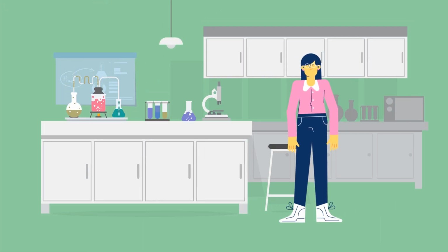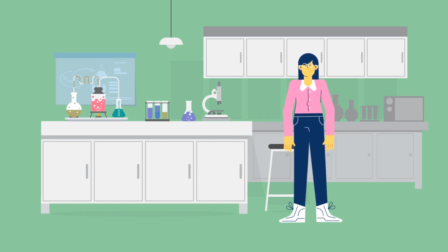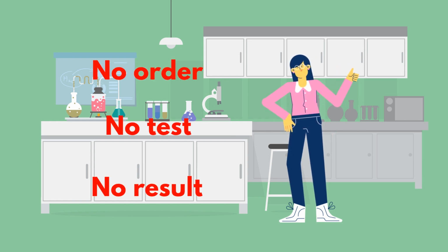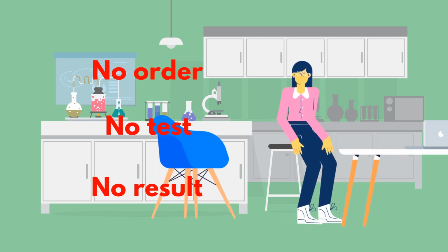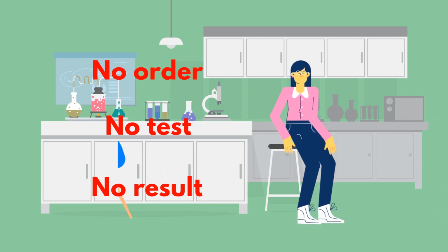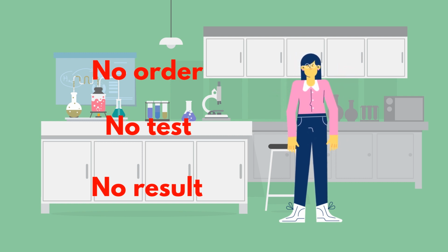It is important to know that the laboratory will not automatically perform a urine culture, even with the same urinalysis test results, if the doctor only orders urinalysis. This is to prevent insurance fraud. The laboratory cannot just add any orders without a physician's order. In some hospitals, we would call the doctor, let him know the findings of the urinalysis, and ask if he wants to add on a urine culture or not. But since this is a reflex test, we would continue and perform a urine culture.